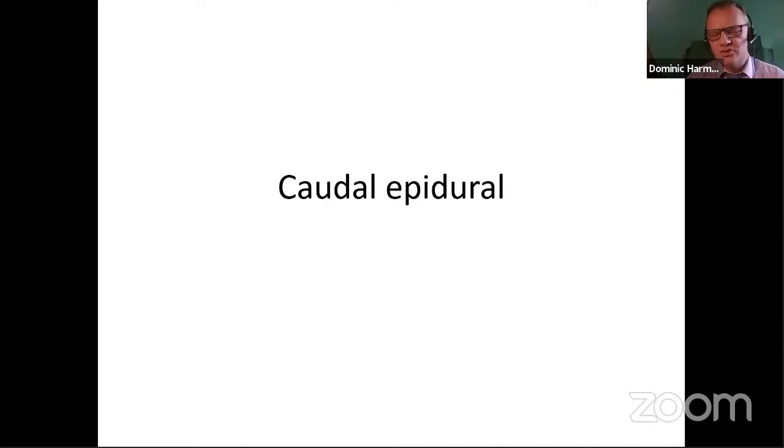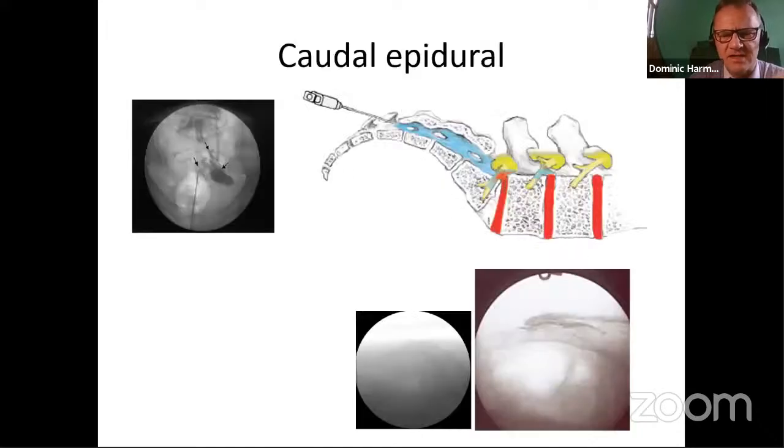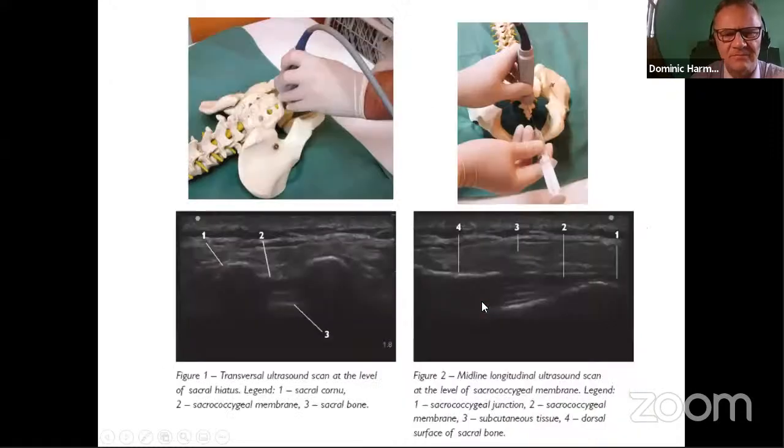Right, caudal epidural, very easy to do with ultrasound, and it travels up around to L2 level, well described. Typically, obviously, this is the pattern in terms of using X-ray with contrast spread. What you're showing here now, and here's the skeleton, and you can actually practice with the skeleton underwater to practice this type of anatomy and practice even seeing the needle.